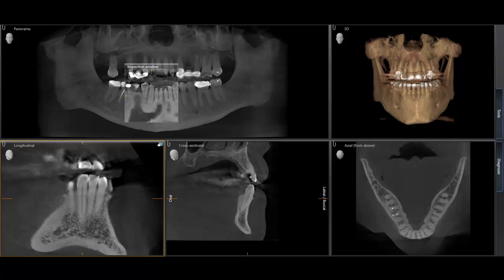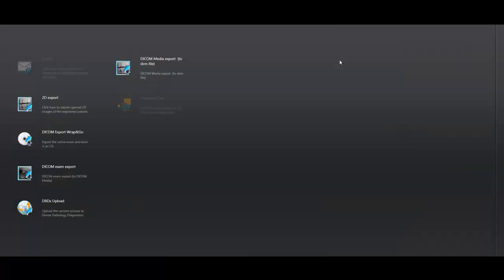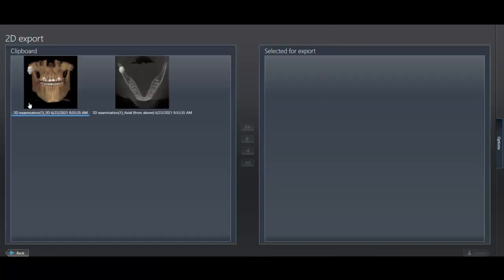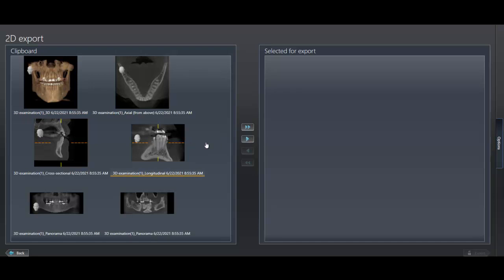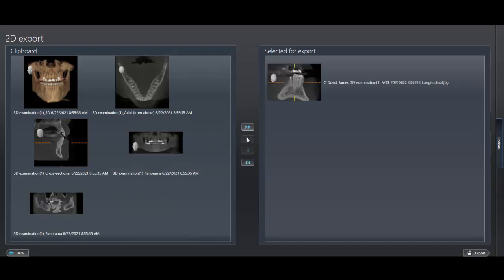So if I go over here to output, 2D export, single click that, push play, and I can now export this into my software, attach it to an insurance claim, or whatever I would like. And now I've got a PA from a tooth using my cone beam volume.